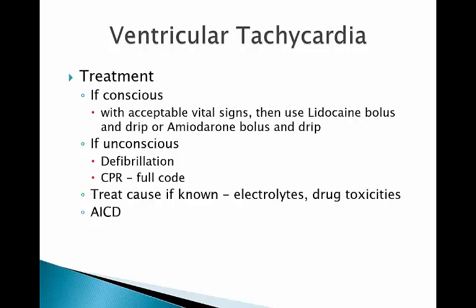So defibrillation, remember, is the higher amount of joules or shocking than cardioversion. So remember, with defibrillation, it can be 200, 300, 360 as far as joules are concerned. So the amount of energy that we shock the patient with is higher with defibrillation because the patient's heart has stopped. Cardioversion, on the other hand, is where we're going to try to get them out of an irregular rhythm and back into sinus rhythm, so we don't need to shock it quite as hard, and we shock it with less energy, like 50 joules.